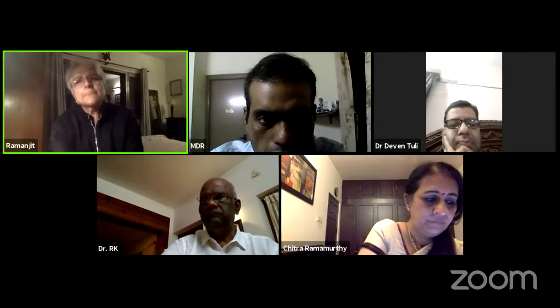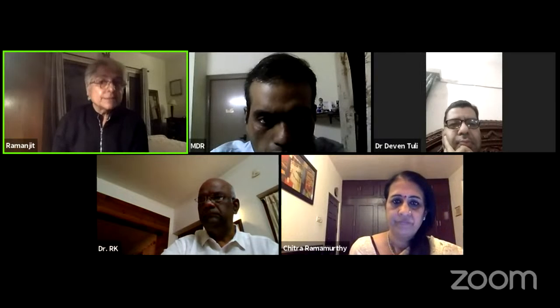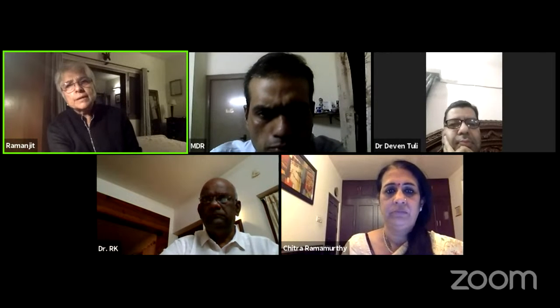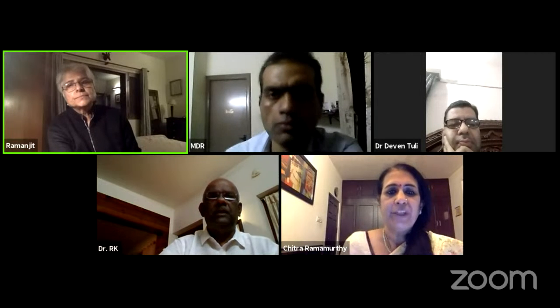Again, it helps us to say, there is an adherence between the iris and the cornea in this quadrant. I should avoid that quadrant and probably do my surgery or any filtering surgery away from any of the already existing adhesions. Thank you very much, Dr. Ramanjit.